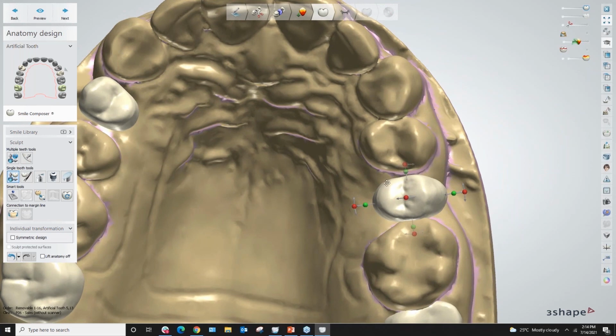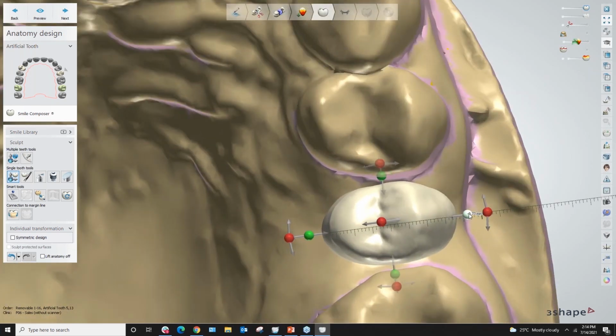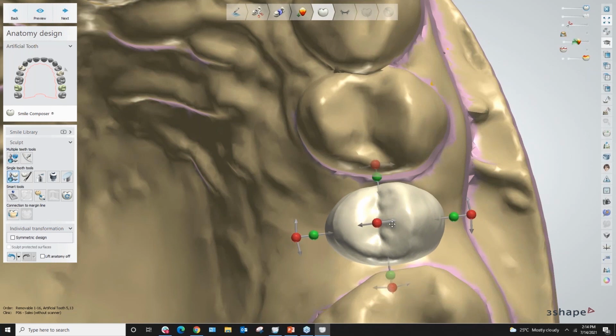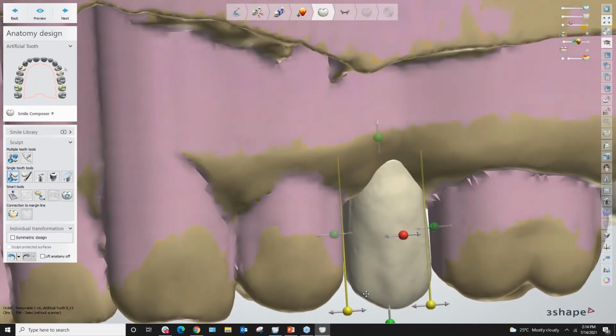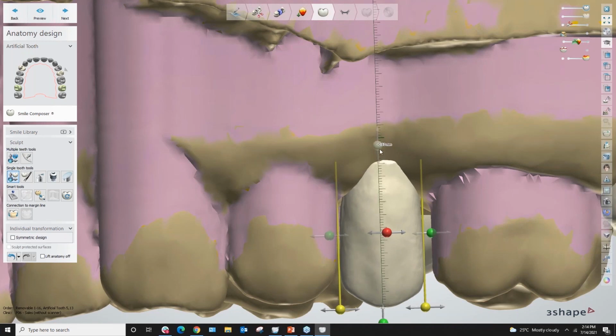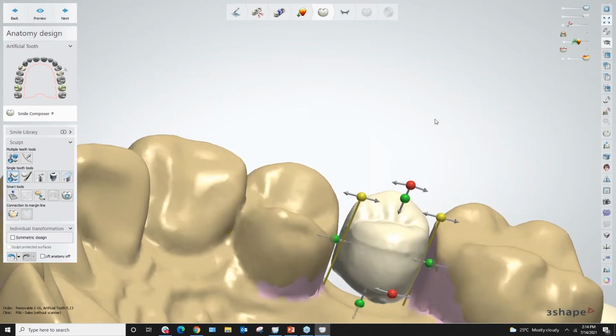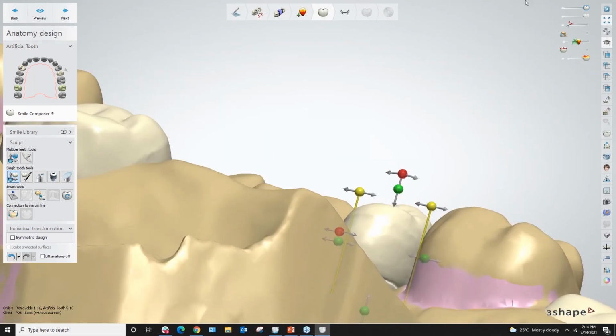And have in mind, I do not have an opposing model for time because it would have been time consuming. And we only have an hour for this particular webinar. But for a live demo, if need to be, we can definitely arrange with your Zahn CAD/CAM specialist so that you can see a more in-depth look of what the software does.